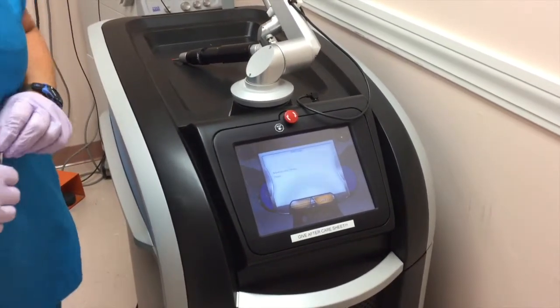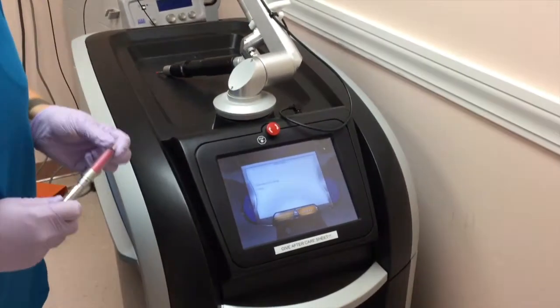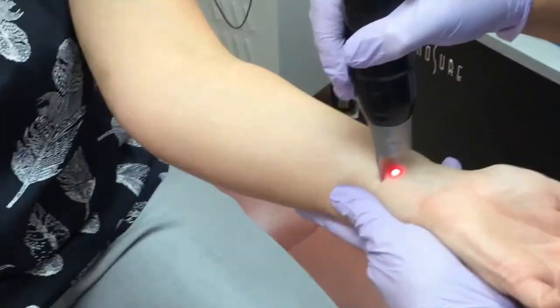And now the laser is warming up still or adjusting? It's adjusting its energy to those parameters that were given to me by Dr. Linden. But I'm going directly over the pigment.